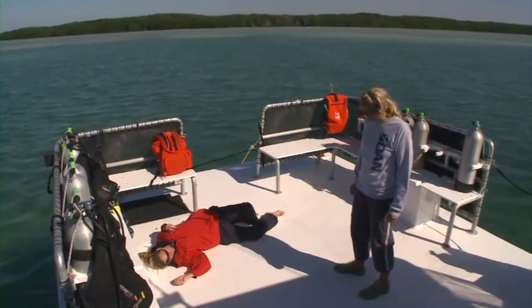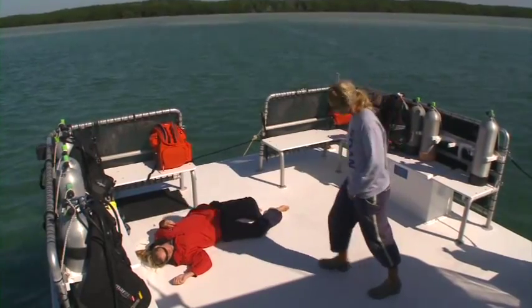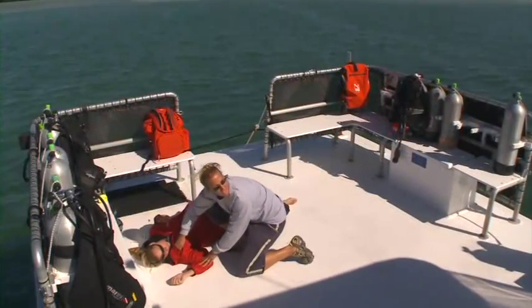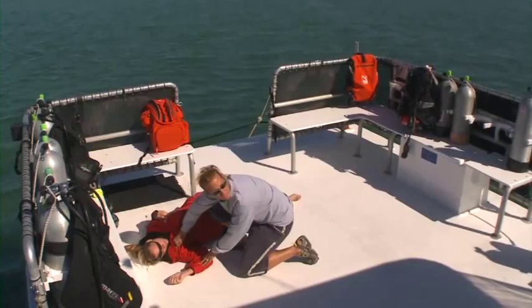After a dive, Tony, are you okay? Danny, I have an unresponsive diver. Can you please bring me oxygen and first aid and alert EMS?